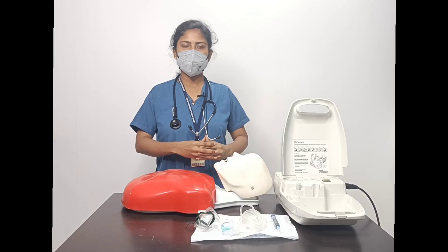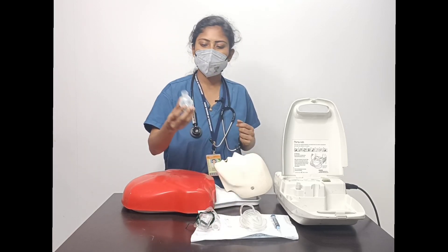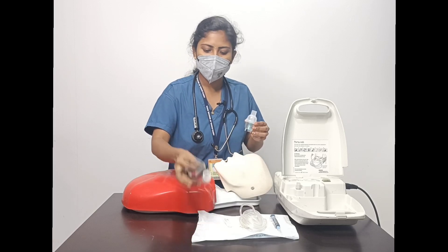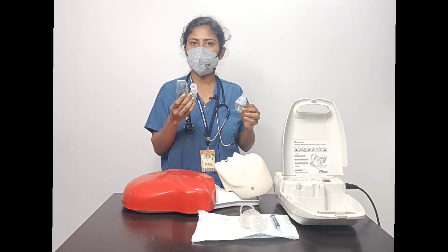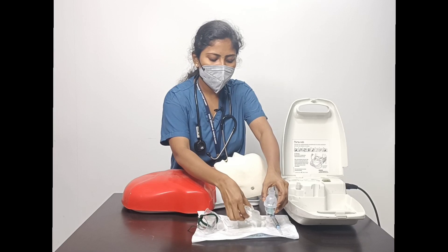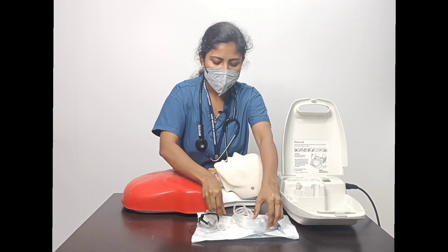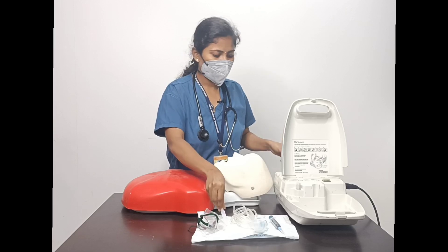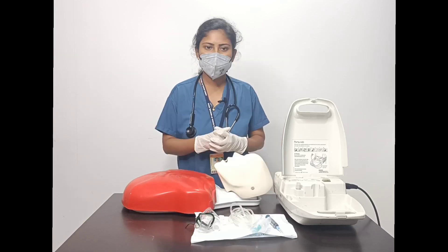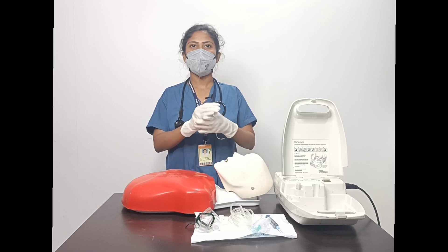Now we gather all the equipment for nebulization. This is the nebulization chamber, this is the face mask, this is the nebulization tube, this is the medicine, and this is the nebulization machine. Before proceeding, we must take standard precautions.